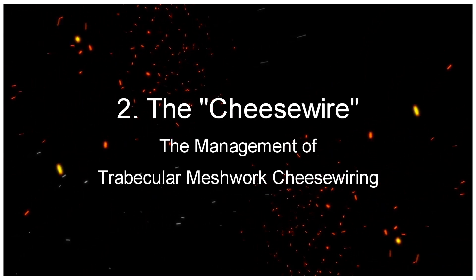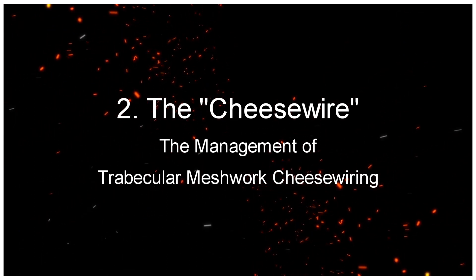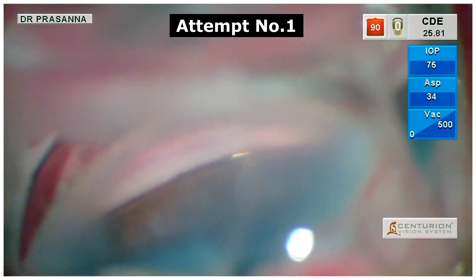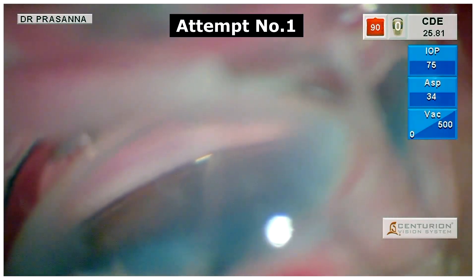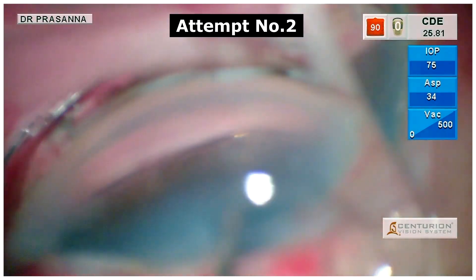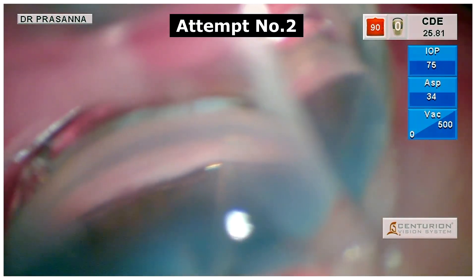The Cheese Wire: The Management of Trabecular Meshwork Cheese Wiring. Every trabecular meshwork has a different consistency. Here we have a case of a very friable trabecular meshwork which cheese wires on multiple attempts for implantation as seen here.